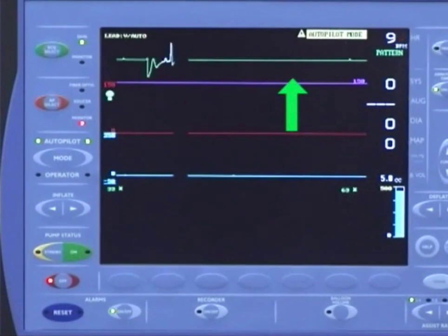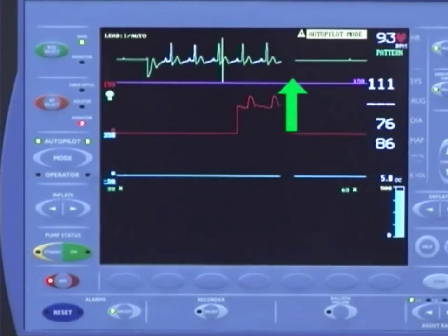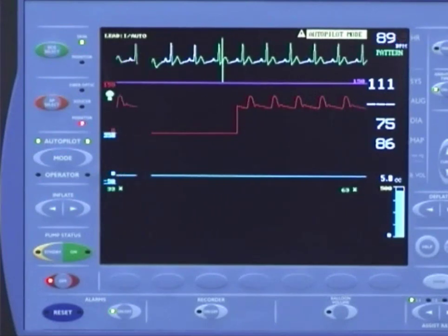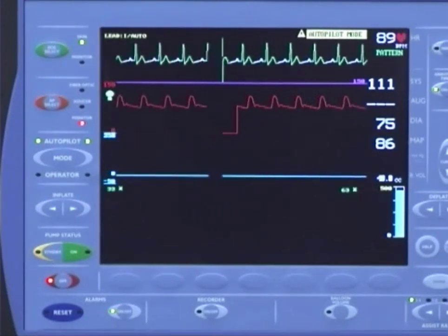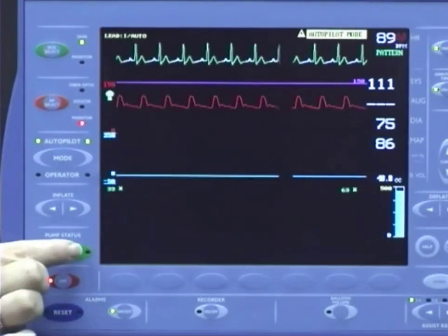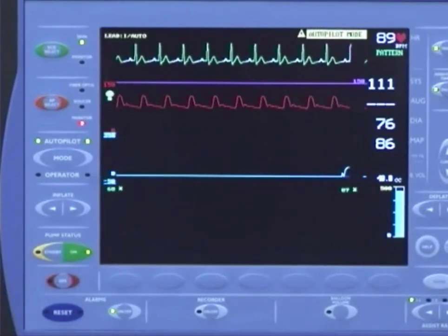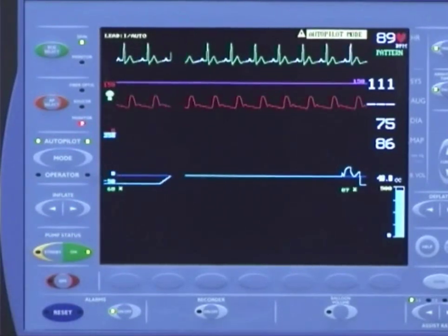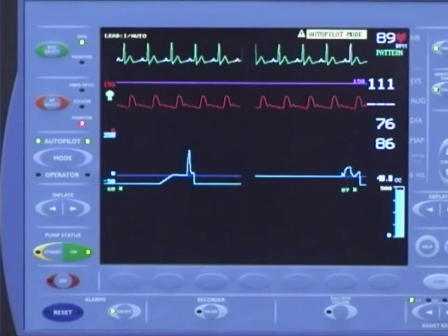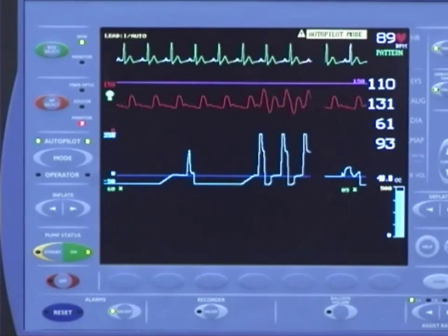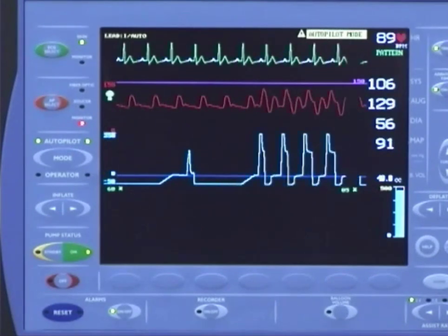In AutoPilot mode, pumping is as easy as connecting the patient to the pump, including ECG, arterial pressure, and the balloon catheter, then pressing the pump on key to initiate assist. The pump selects the best signal sources, trigger mode, and timing method automatically.